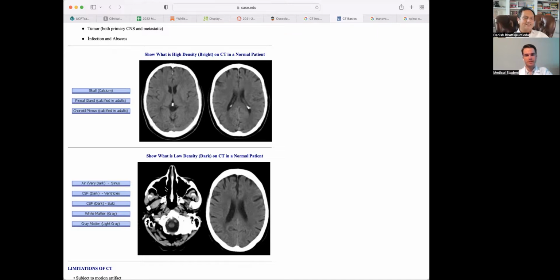You can see the air pockets here. You can see the CSF pockets in here. You can see the sulci; a sulcus, which has water coming in, will look like this. And then of course we have a gyrus, and the outer rim of the gyrus will be whiter. And then the center of the gyrus will have the subgyral white matter, which will look like gray going in.